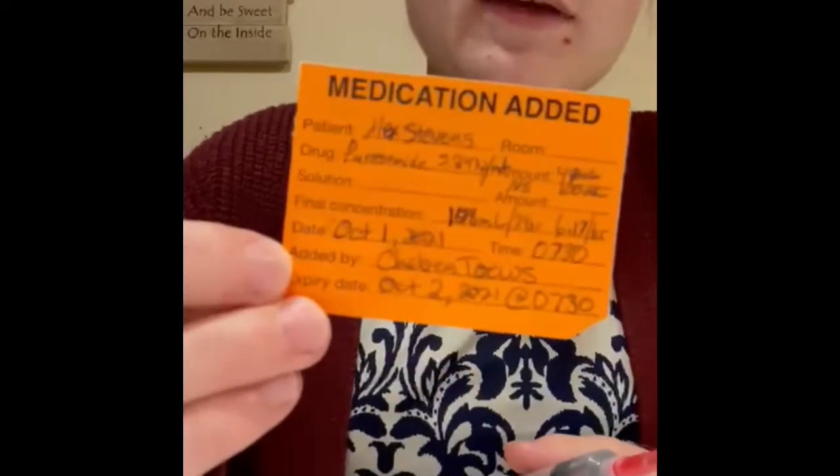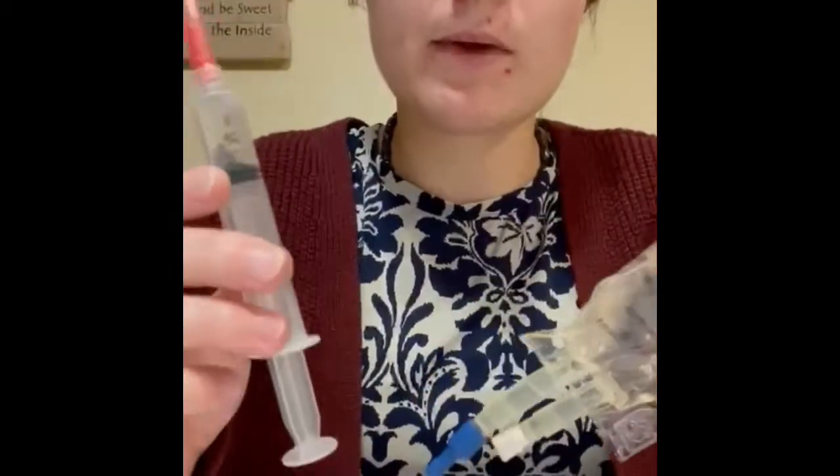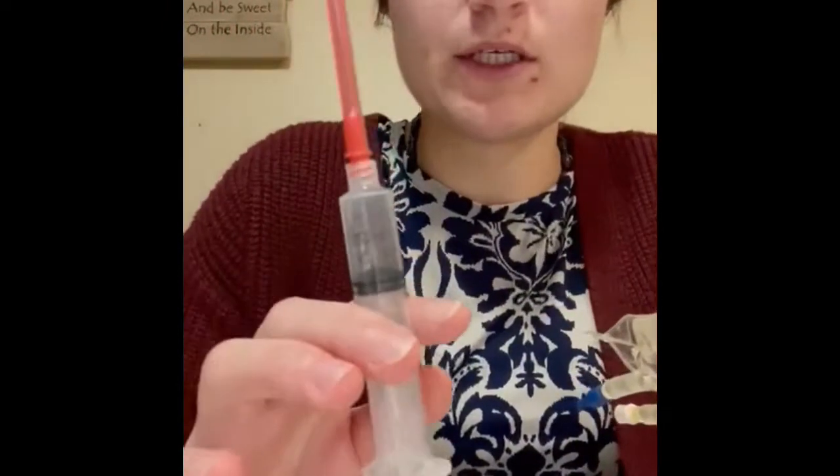And then I'm going to make out a label of what is in here. So my label I've written out. It's ready to go, and I've got this and this. So next I need to put my medication. So let's say I've done this to each and every one of my 12 10 mLs. So I have 12 of these with 4 mLs in each. And I'll have them all here. And then before I inject it into here, I'm going to do my second check for each and every one of them. So I'm going to make sure it's the right amount.